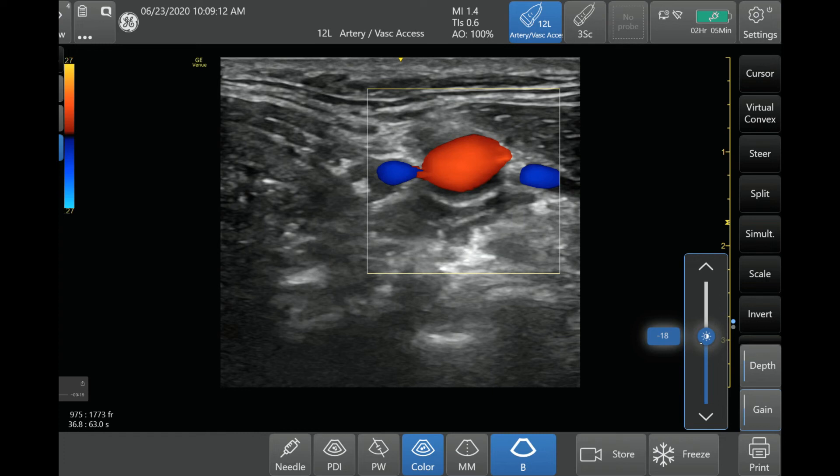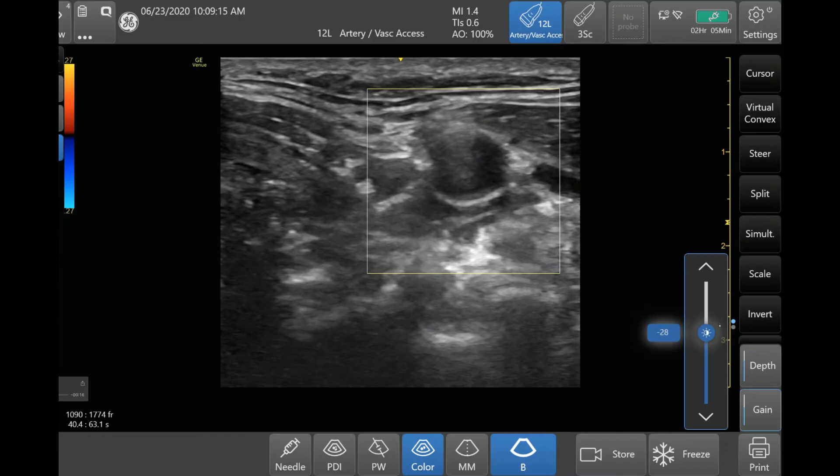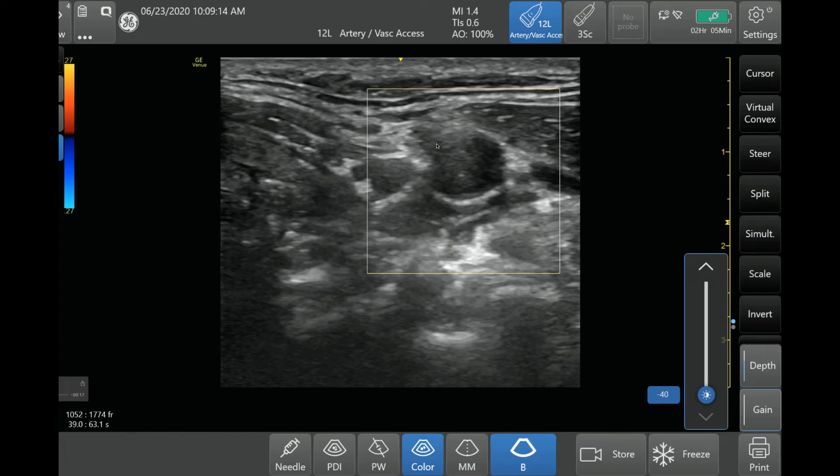I'm going to show you an example — I'm going to decrease the gain all the way. As you see, when the gain is at minimal, you see no color flow at all, because it's telling the ultrasound system not to pick up any of these signals.